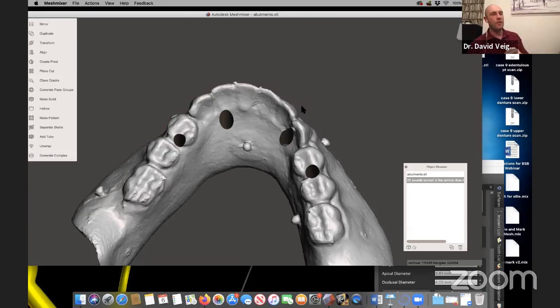So if I was going to drill a full arch without pins, I would put the surgical guide in position, and I would drill my first site, and I would keep my hand on, and I'd walk all the way around. And then what I would most likely do is go back to my very first pin site, and actually put the burr back into the guide and let that act like a pin, and then go back and do my other sites, just to help keep that stable if I haven't created my own pins. So you can use the burrs themselves as pins inside the osteotomy holes.